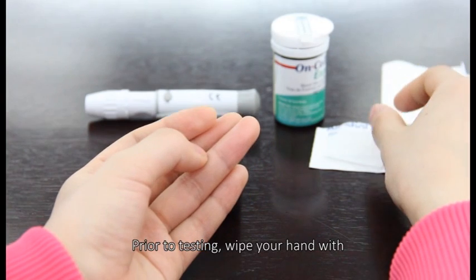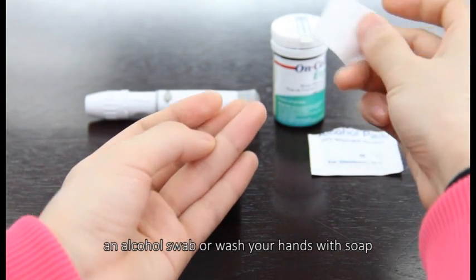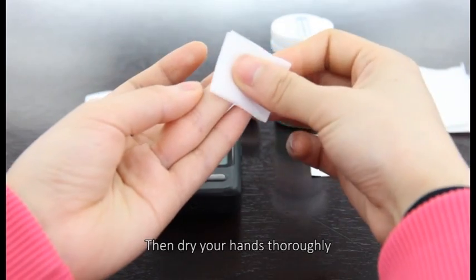Prior to testing, wipe your hand with an alcohol swab or wash your hands with soap. Then dry your hands thoroughly.